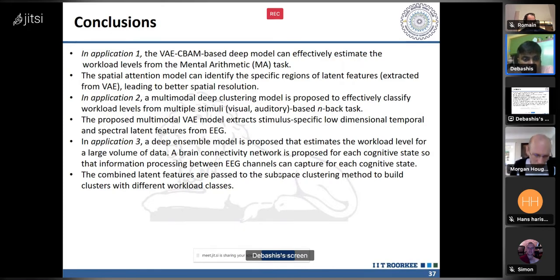That is the first mental arithmetic test. And the second arithmetic test is different. One is the baseline task, which means the resting state, the same as the first one. But in the second state, the arithmetic task, the participant has to do one subtraction, maybe 387 minus 9.